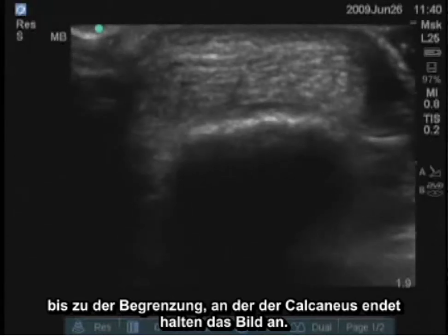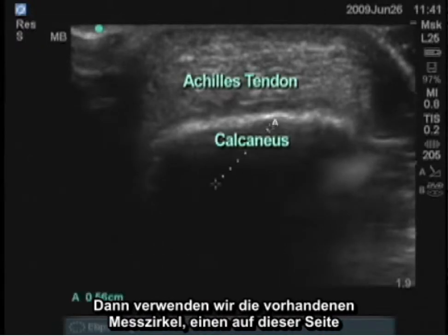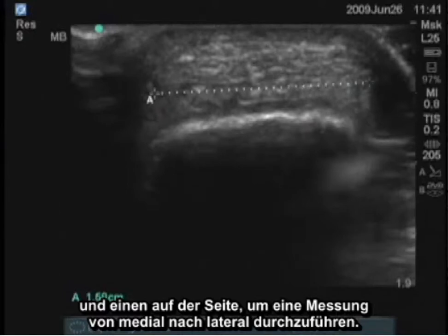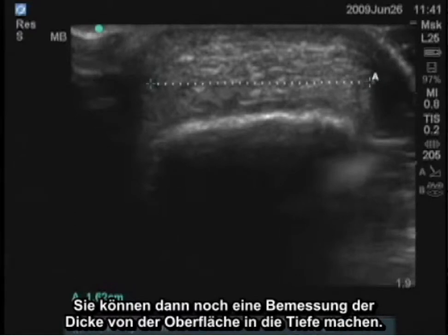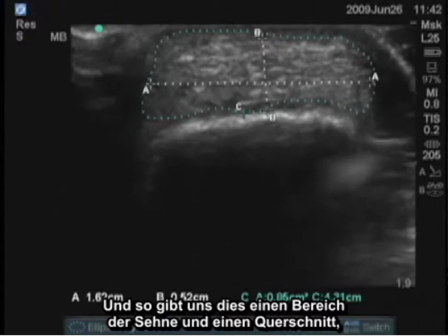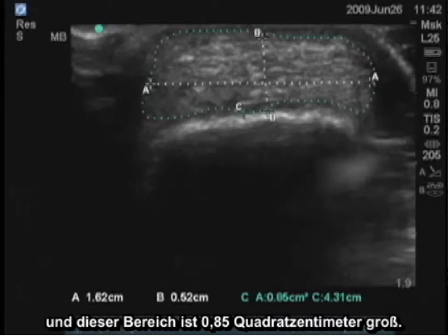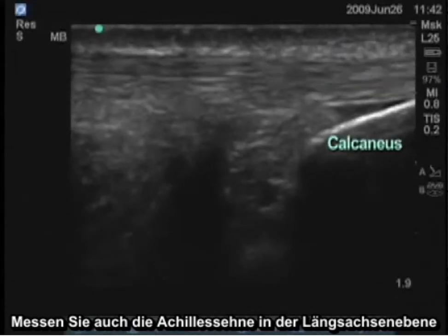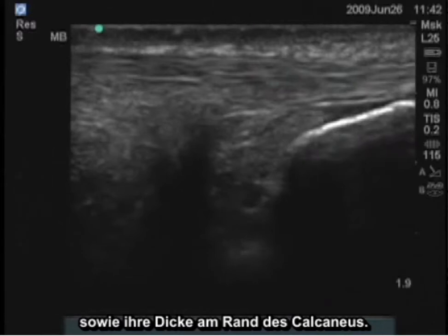Using the calipers, we place one on each side to get a measurement from medial to lateral. You can then get another measurement of thickness from superficial to deep. You can also measure the area — probably the best way to do it is manual — giving us the area of the tendon in cross section, which in this case is 0.85 centimeters squared. You can also take measurements of the Achilles tendon in the longitudinal plane and measure the thickness at the edge of the calcaneus.